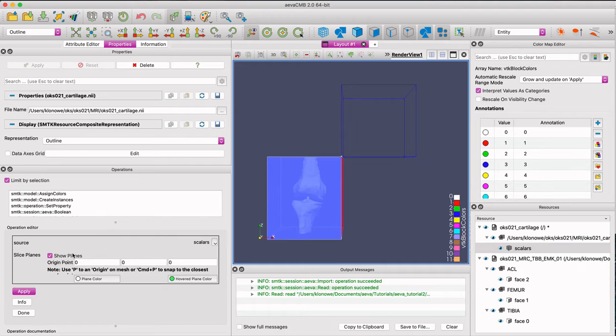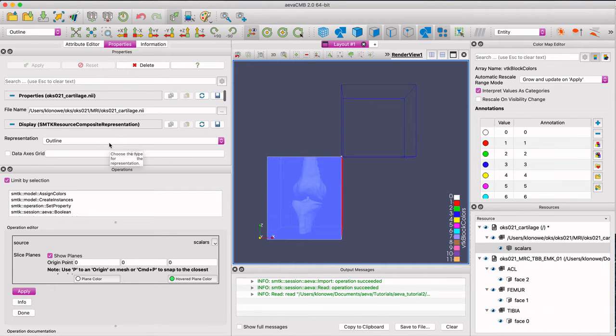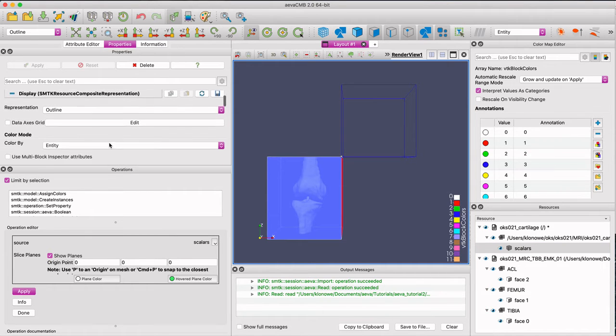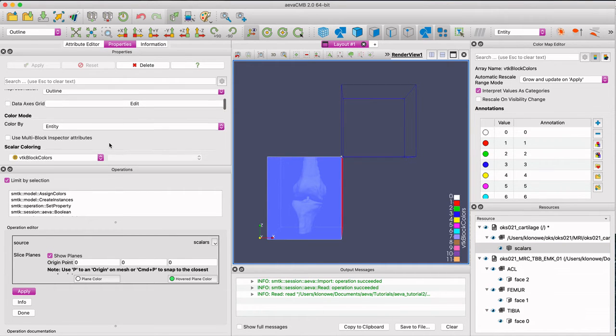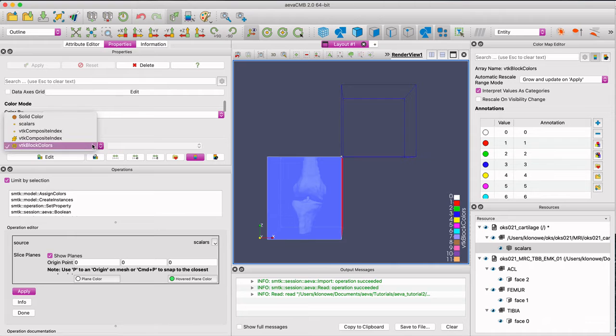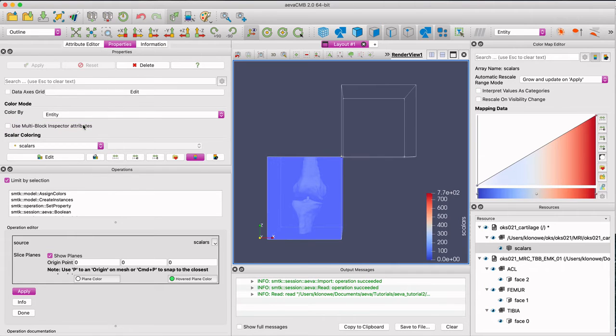To display the volume, make sure that the display representation is set to outline, color mode by entity, and scalar coloring set to scalars.